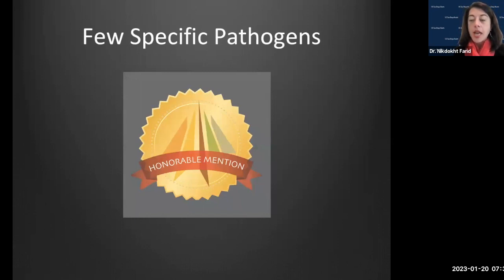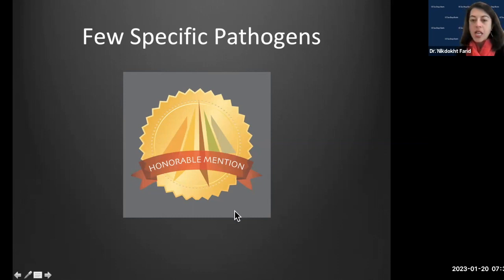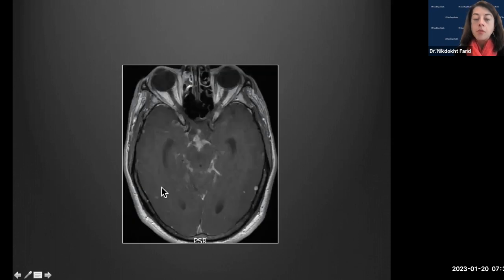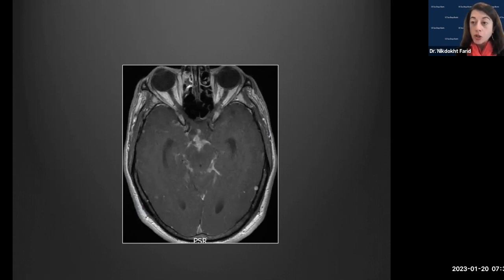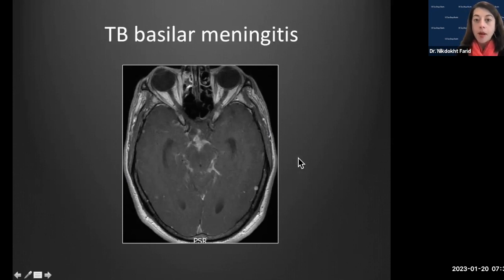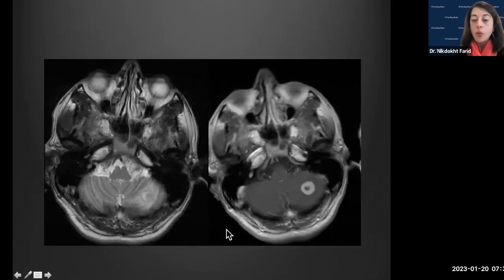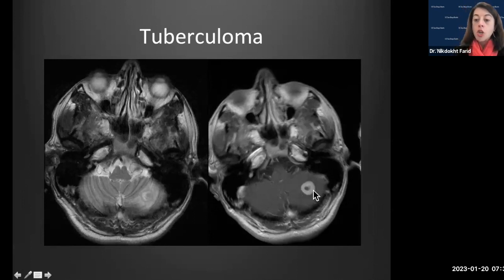That completes the anatomically-bound infection component. Now moving to specific pathogens: case three showed an axial T1 post-contrast image with thick enhancing process involving the basal cisterns — TB basilar meningitis. Another TB presentation is a tuberculoma: a rim-enhancing lesion in the left cerebellum with a very thick wall. The central aspect is T2 iso-intense rather than bright, reflecting a granulomatous rather than frank purulent process.